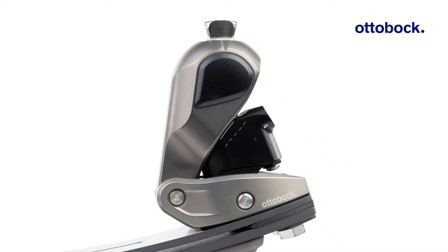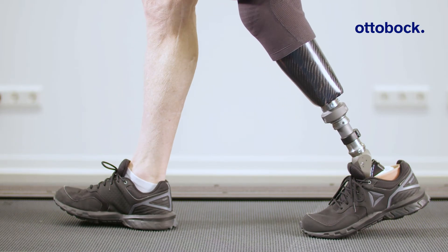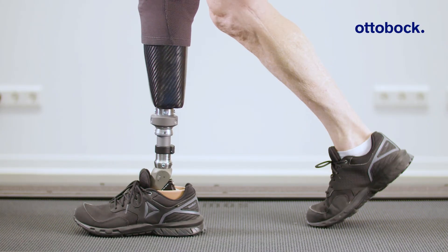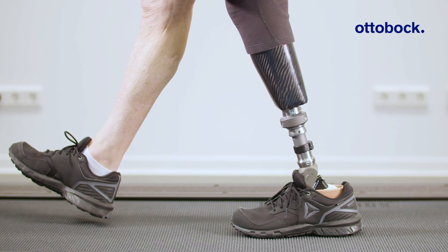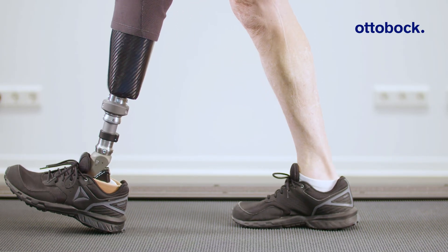The hydraulic ankle of the Taleo Adapt provides a range of motion of 12 degrees. The 10 degrees of plantar flexion motion supports a smooth transition to foot flat after heel strike. The additional 2 degrees of dorsiflexion motion facilitates easy roll over and improves toe clearance during swing phase.